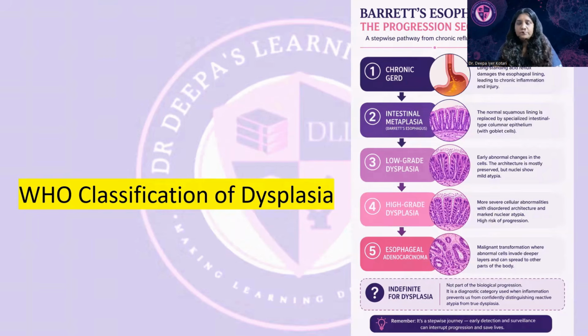Okay. So once the Barrett's esophagitis has been diagnosed, the next step for the pathologist is to determine whether dysplasia is present. I told you already, but I just wanted to repeat myself on this. The different groups are negative for dysplasia, indefinite for dysplasia, low grade, and high grade.